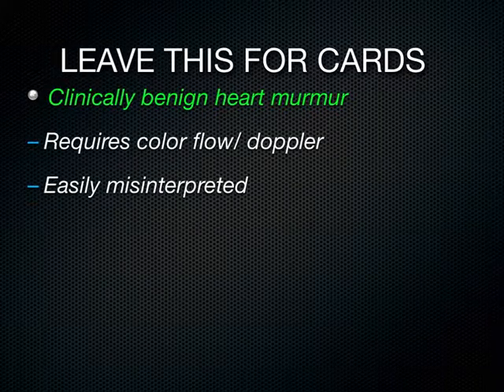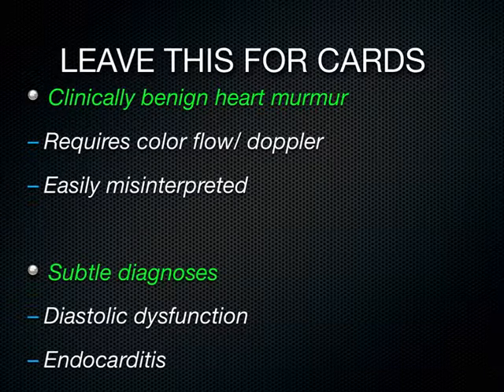But there's stuff we're going to leave to cardiologists, like the heart murmur. You come out of the room and go, hey, the patient's got a heart murmur, want to go look at it? Yeah, I'm sort of curious, as any doctor would be, to see what the murmur looks like. But differentiating how much TR, MR, 1+, 2+, really has no clinical bearing for me as an emergency physician, and it's easy to misinterpret those color flows across the valves. Other things like early diastolic dysfunction and endocarditis, I've hallucinated hundreds of times now. Just stay away from that stuff unless it's super obvious.